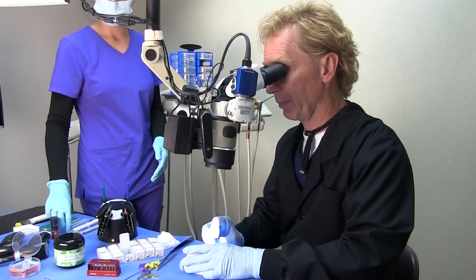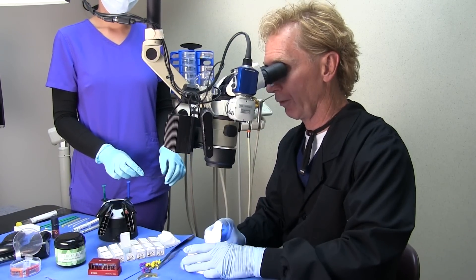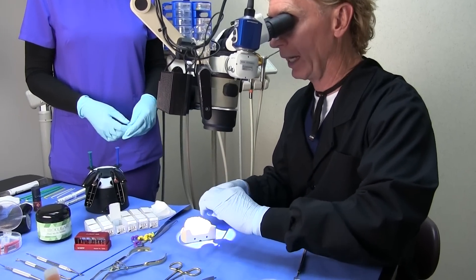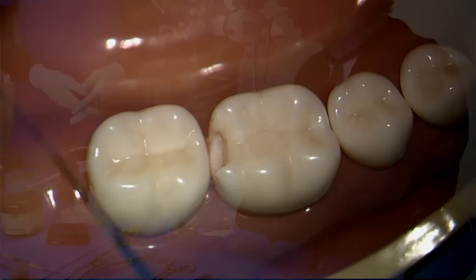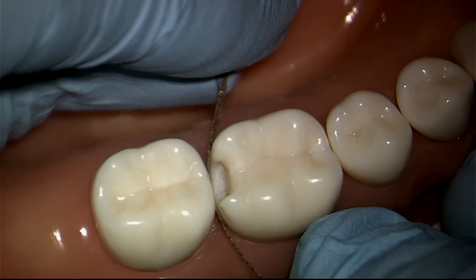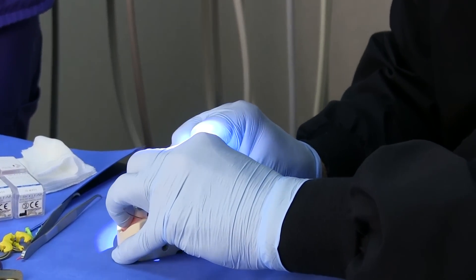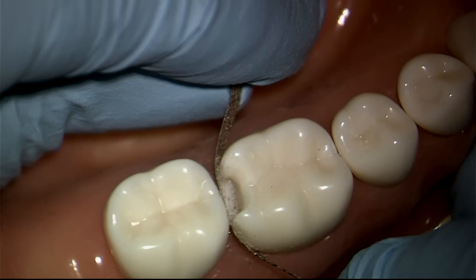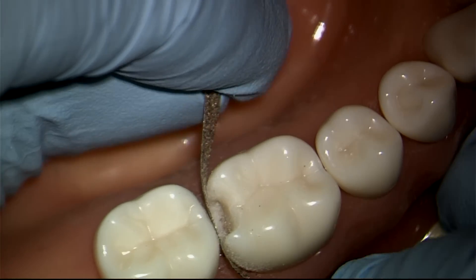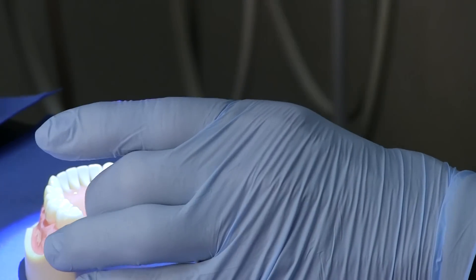The next thing we need to keep in mind is that we always want to take a lightening strip to create a true infinity edge, remove biofilm, and break the contact if the contact is not broken naturally. This is actually a great way to prevent nicking the neighboring tooth. We're going to take a lightening strip, removing all the calculus, creating a nice long sanded surface all the way out to the line angles. This allows us to get a true infinity edge and start thinking about a CAVO surface driven, non-retentive Class II, instead of old-fashioned GV Black retentive cavity preparation.